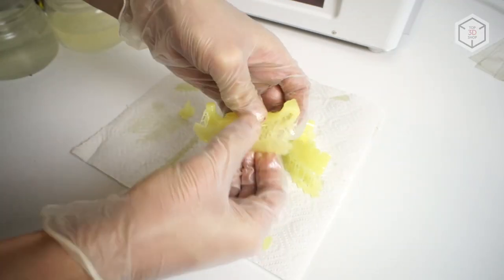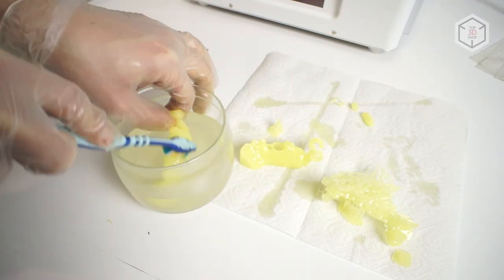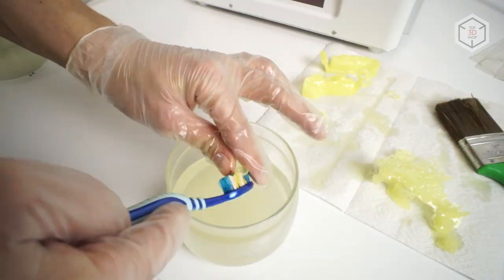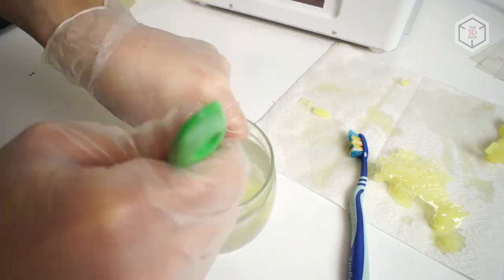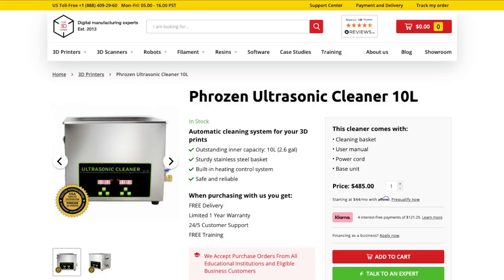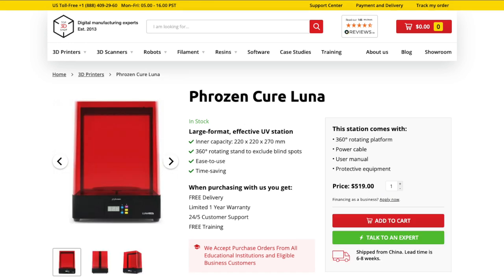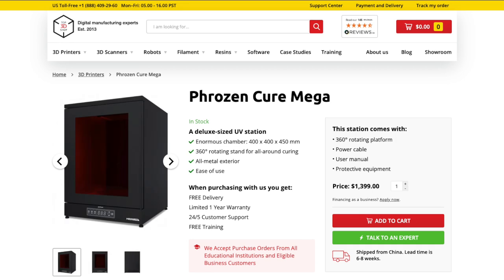After printing, all models were washed and supports were removed. By the way, we washed the models by hand using regular brushes. The curing was carried out simply in the sun. In a professional environment, of course, special devices are usually used for these procedures, such as ultrasonic washing vats and dedicated UV lighting chambers. Such devices greatly simplify this stage of post-processing and save time.